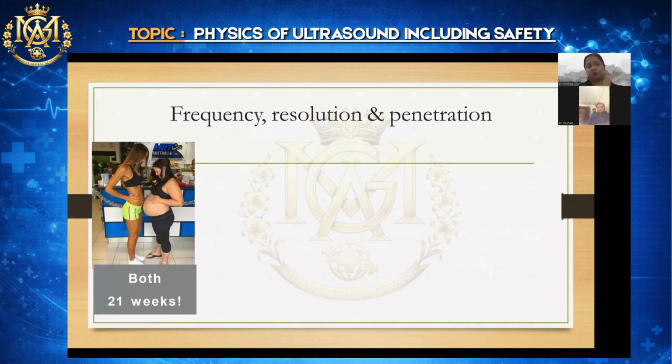these are two pregnant women, both are 21 weeks. Do you feel that if you use the same probe, you will get better images in both the patients, or do you need to do some modification in your probe selection, in your ultrasound technique?